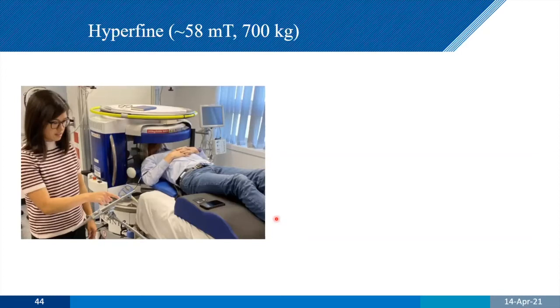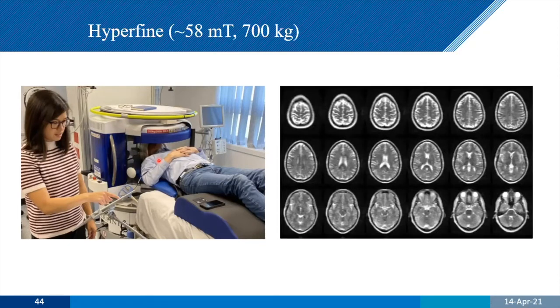And although it's portable, this thing is 700 kilograms. So portability is in the eye of the holder. To get around a hospital, it's perfect. It's on wheels. It's very elegantly designed. It's got very easy access for patients over here. And of course, if you want to study people in the ICU or had a stroke or anything, it's really a revolutionary design here.